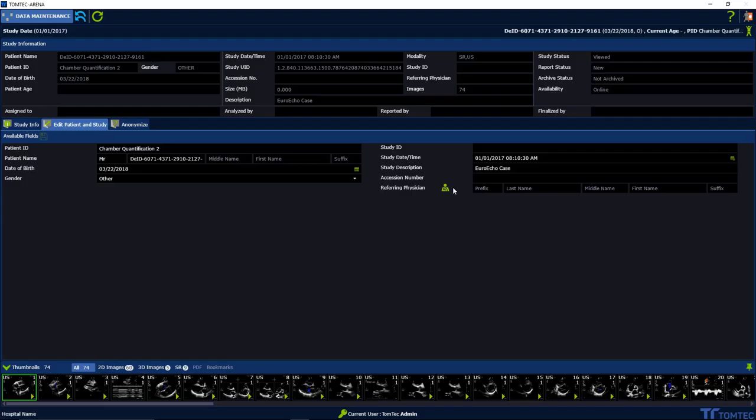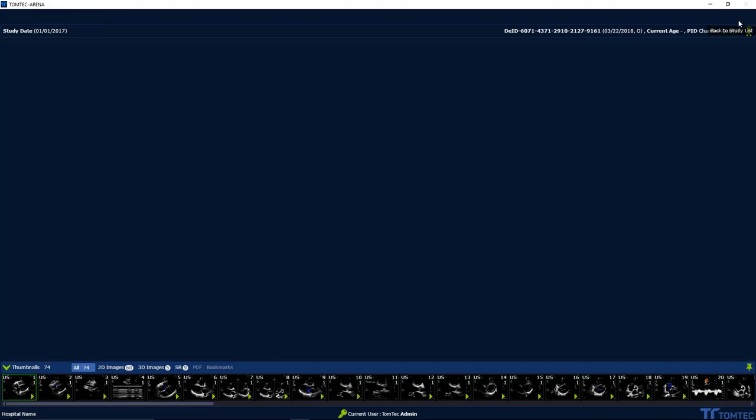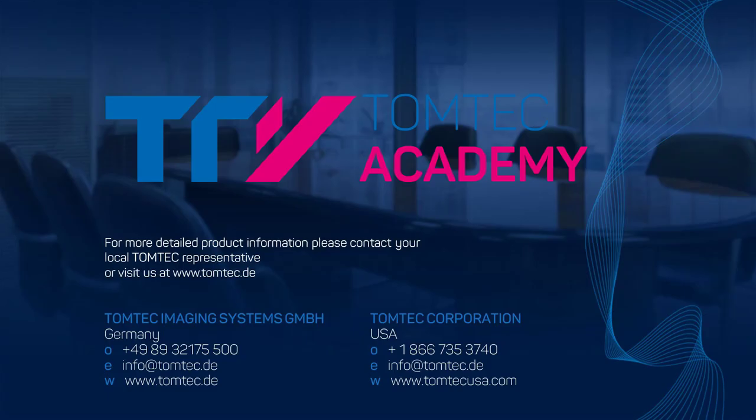When finished, on the right upper hand corner, leave the menu back to the study list. Thank you.